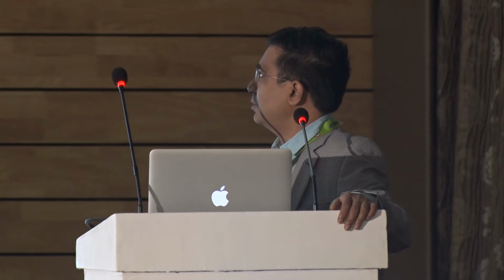You can see the fibrotic anterior capsule with a small speck of calcification in the central area. So I thought I will go with a main incision and side port, and stain the anterior capsule. But whenever you see some star folds on the anterior capsule, assume that your capsulotomy is going to be difficult. So you may have to use Vannas scissors or cutting scissors to make the capsulotomy adequate. And during this time, you may sometimes weaken the zonules. So sometimes you may have to stabilize the zonules now that the central capsule is removed.